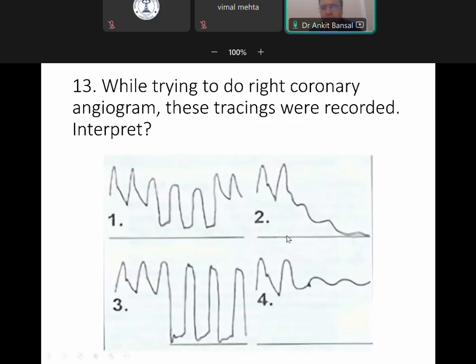And what is this? You have done the angiogram and now suddenly you see your catheter pressures are somewhat not looking good. This is because you are using a fluid filled pressure system. This is dampening because of the contrast. Now your whole system is filled with contrast. Here the good pressures are because initially it may be filled with saline or blood, which are relatively less viscous. Now your whole catheter is filled with contrast, and contrast is more viscous and it is not transmitting the true pressures.